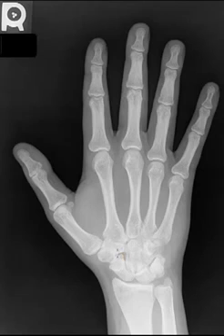Here is the scaphoid. Now the scaphoid is a very important bone and should be paid close attention to because this is the most common carpal to fracture. Typically the fractures in this location will occur by what we call FOOSH injuries, also known as falling on an outstretched hand. So any type of activities in which a person may fall and want to break their fall using their hand, this particular bone is very susceptible to fracture in those types of mechanisms of injury.